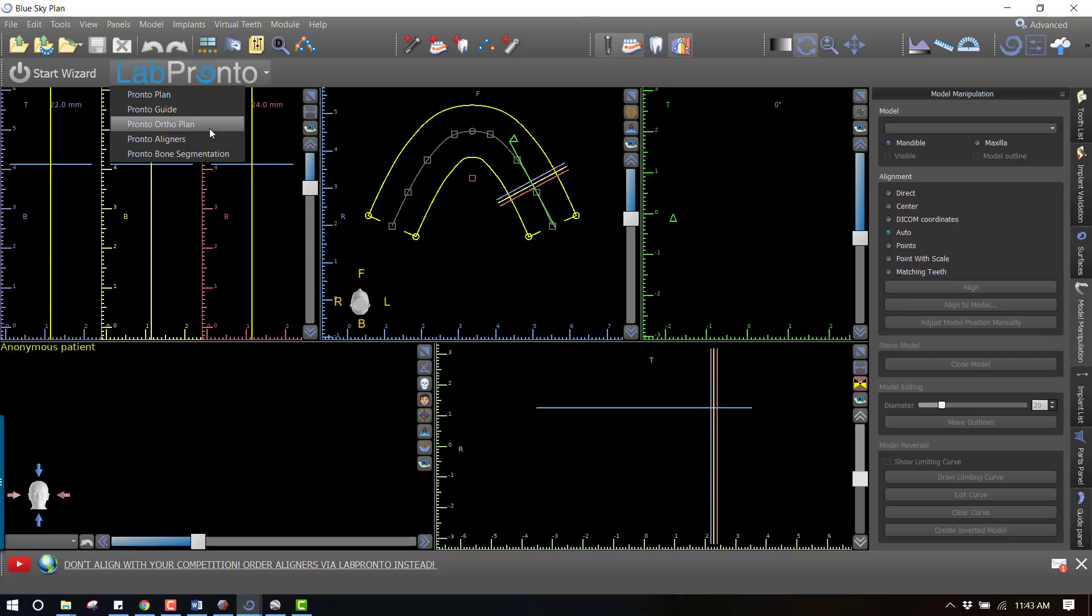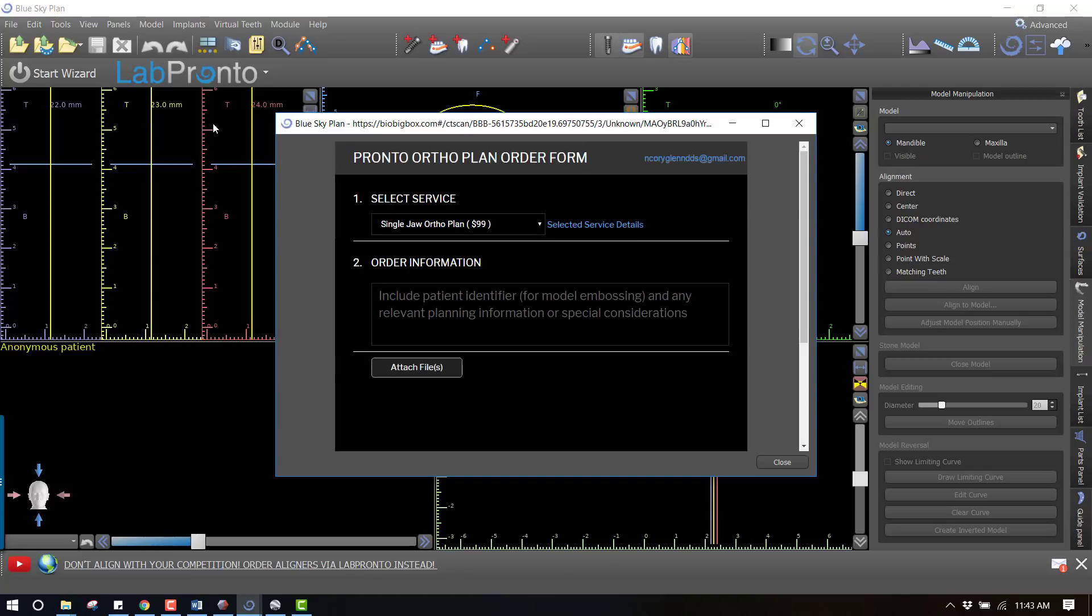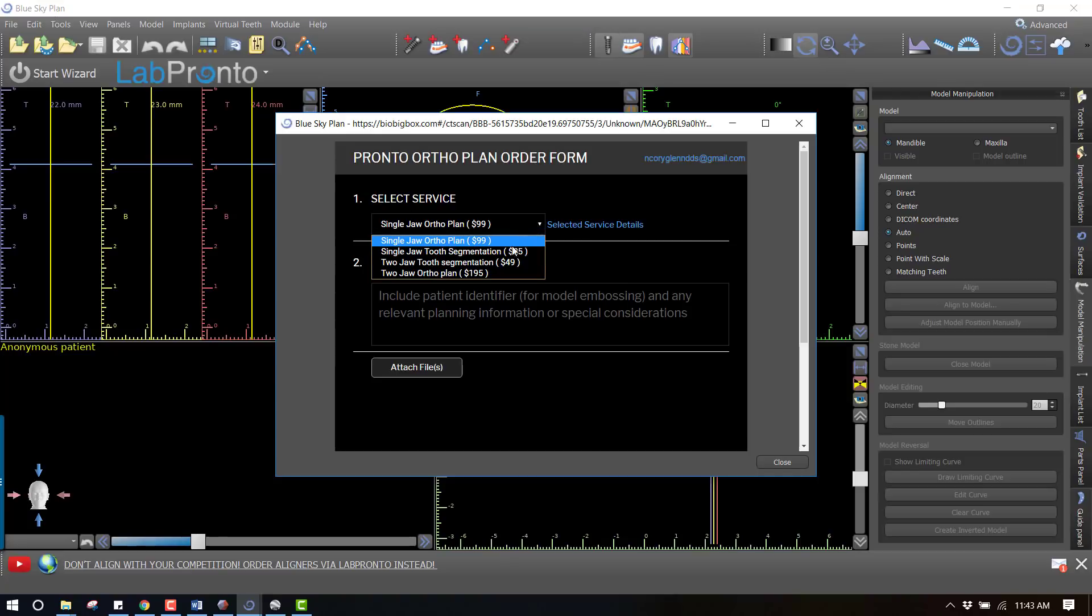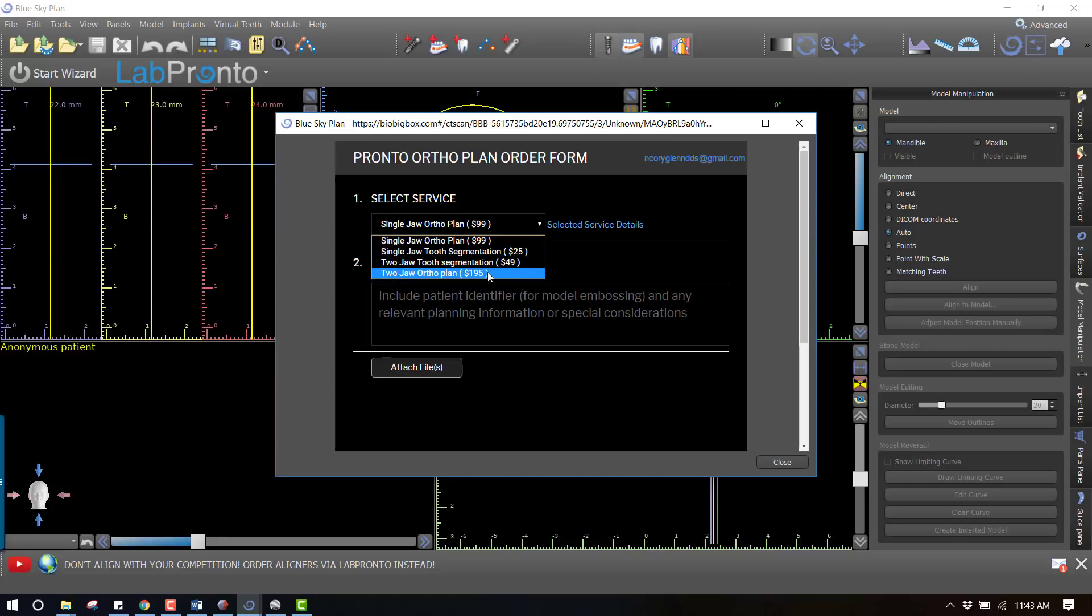What I would like to do in this demonstration is get an orthodontic plan done, so I'm going to click on ortho plan. In this case this is going to be a two jaw ortho plan - this means that they're going to not only segment the teeth but also move them into the ideal positions and generate the STL models which I'll be able to print at my place and then fabricate the aligners. If you just wanted them to do the segmentation, which is the most tedious part, that's only $49 for two jaws - very affordable. If you want someone else to take the process all the way through to completion, let's do that two jaw ortho plan.